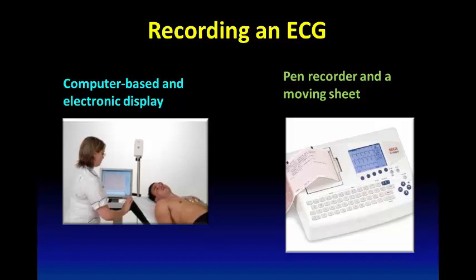The ECG leads, the actual records which we see, are composed of ECG waves, ECG intervals, and ECG segments. And for simplicity, let's record only one ECG lead and identify the ECG waves, intervals and segments.